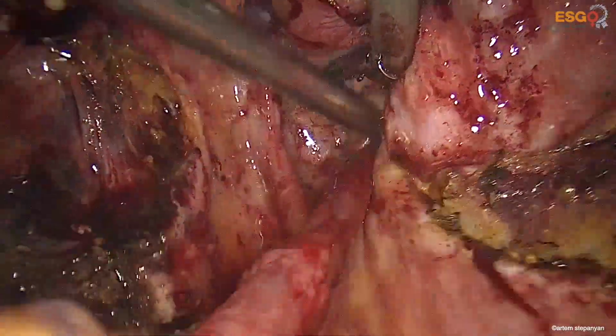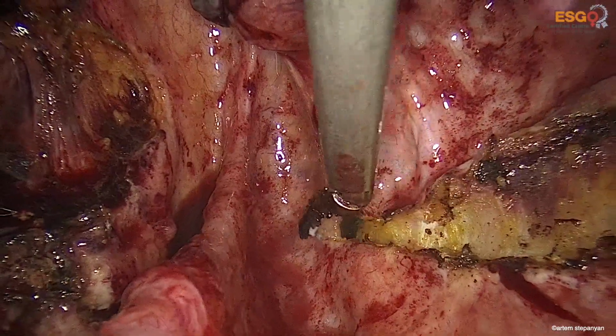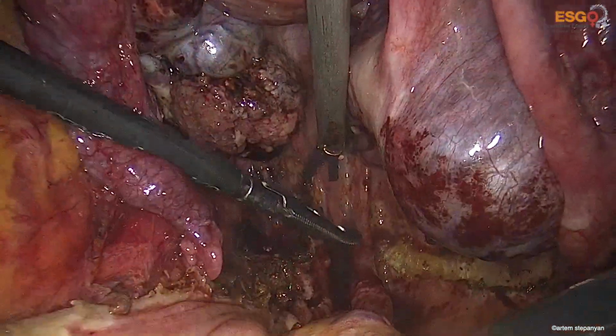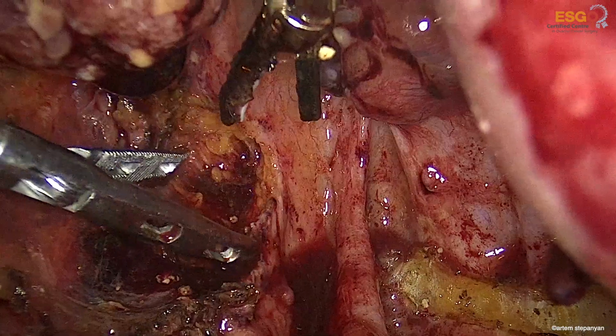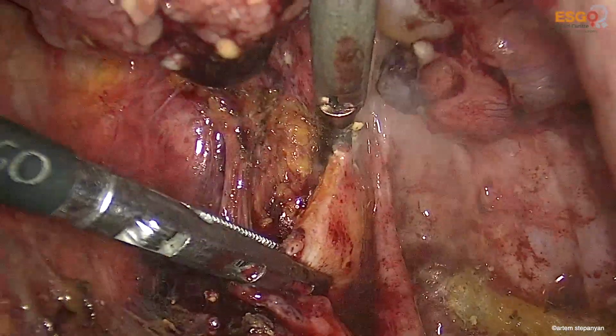and the lateral wall of the rectum, which is the part of the Douglas's pouch peritoneum. And here we see that the peritoneum to be removed is well demarcated. This is the rectum, highlighted pinkish.